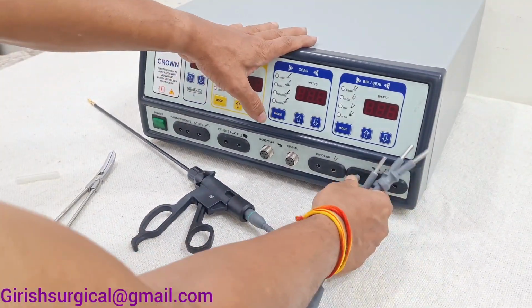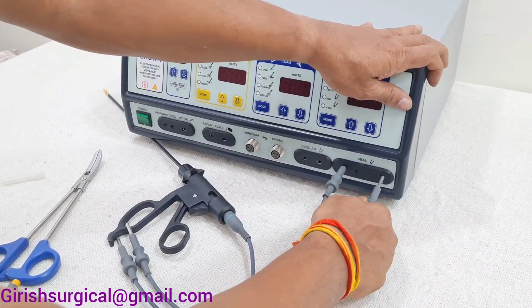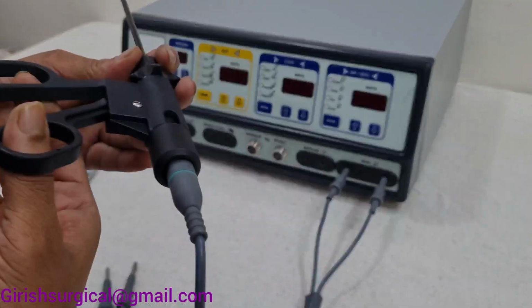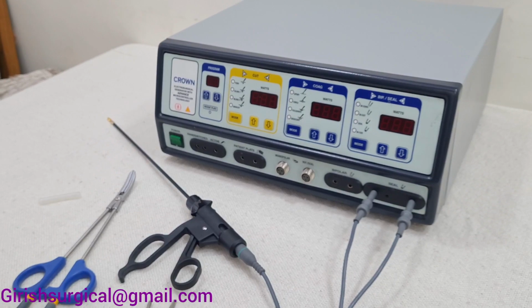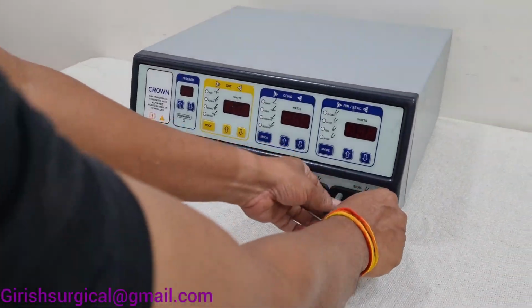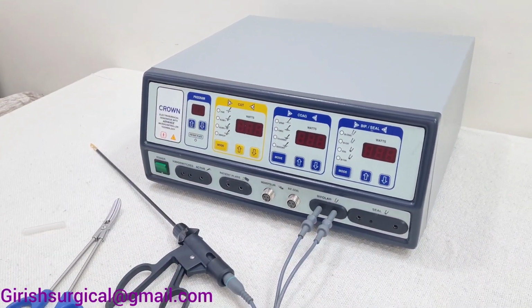So this cable you have to remove and insert the sealer cable rod like this. When you are doing the bipolar TUR underwater, monopolar or bipolar, at that time you have to insert the two banana jack pins here and the other part to the working element.